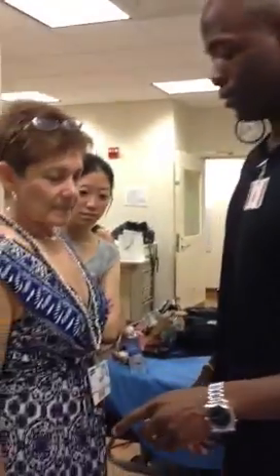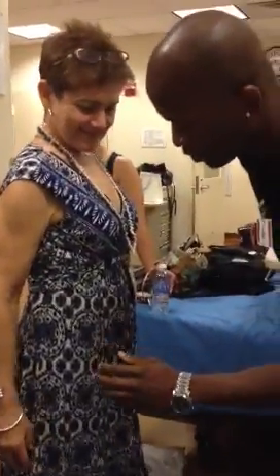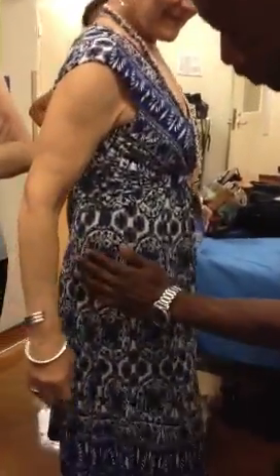Okay, all right. So I'm gonna put all this down here. Okay, so this side. I'm going to use my left. Very good. I'm going to first ask you to bend your leg so I can find the trochanter. And so you have to feel, right?